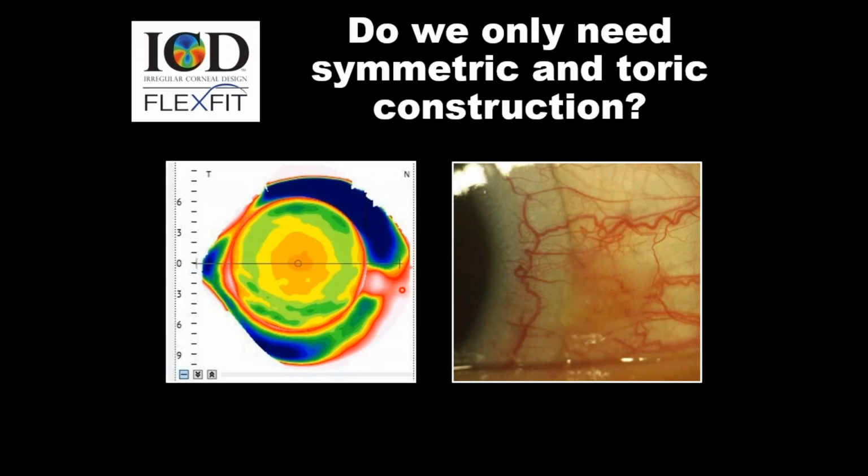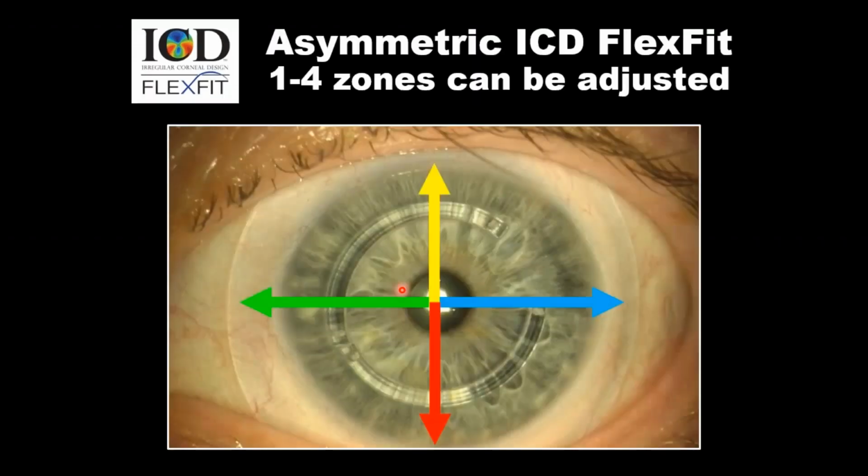Because normally with a corneal GP, we're well within or inside of that elevation. And when we're dealing with the soft lens, it normally just drapes over top, but the scleral lens can impinge right in the middle. It can be abutting up to the edge of that raised elevation or sitting across and crushing it down. So there are times when we need to alter for that raised elevation.